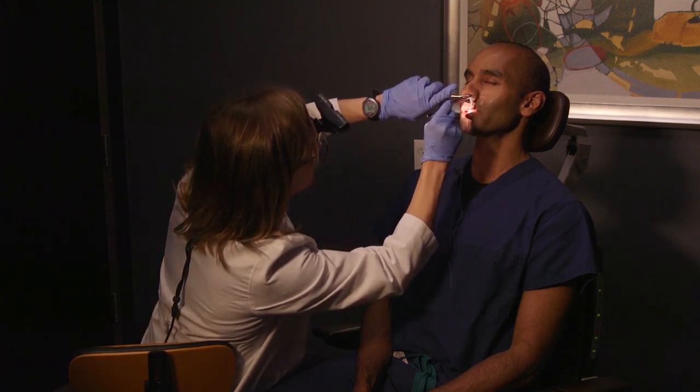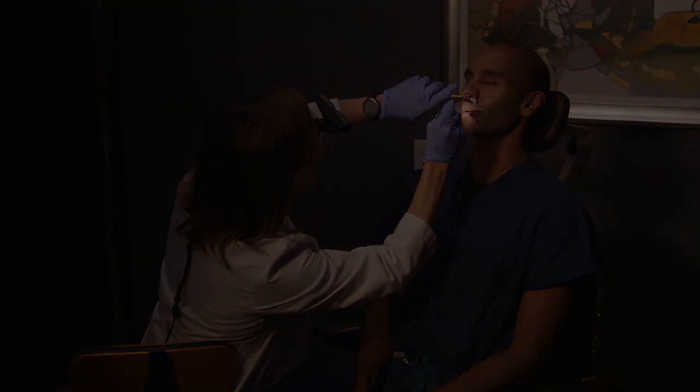There's a bit of a weirdness factor with something going in your nose, but it's actually not a big deal at all. Now we're going to wait and let these kick in.